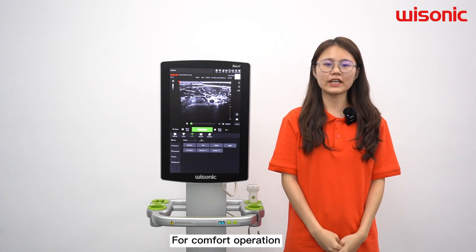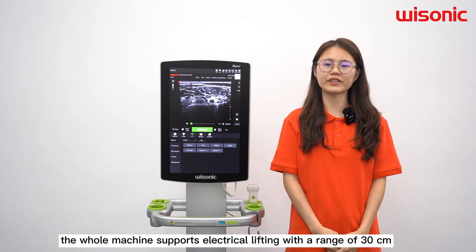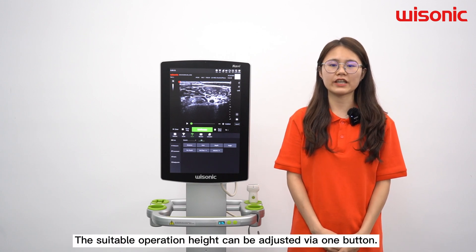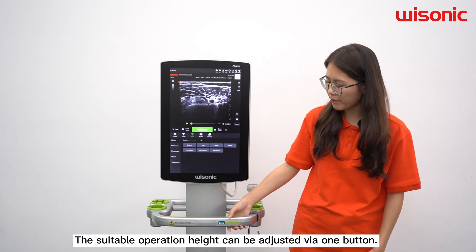For comfortable operation, the whole machine supports electrical lifting with a range of 30 cm. The suitable operation height can be adjusted via one button.